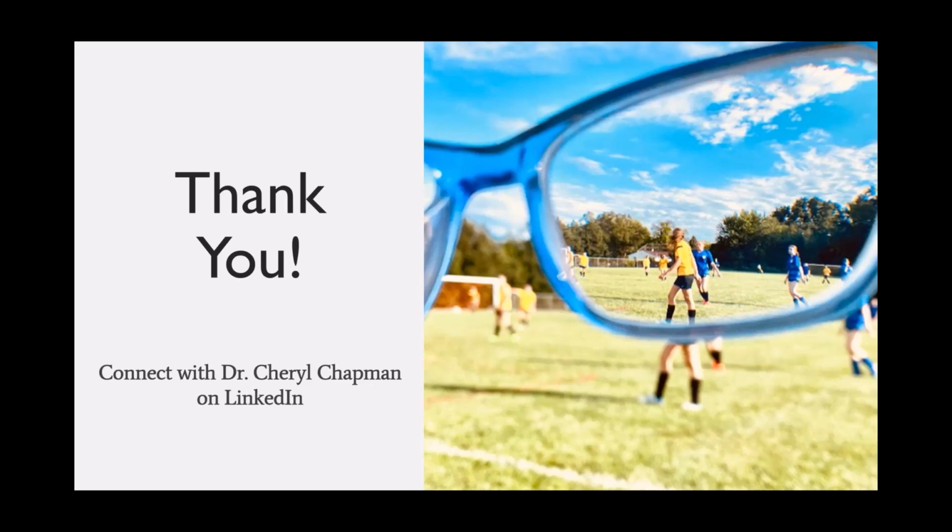And that'll give them what they need for their distance vision and their near vision. Or maybe sometimes you have one eye with a larger treatment zone than the other eye. So there are some ways to do it, but you definitely have to keep in mind that the conversation is sometimes different, setting the expectations is different, and managing the outcomes can be a lot more chair time than it is with the younger patients.